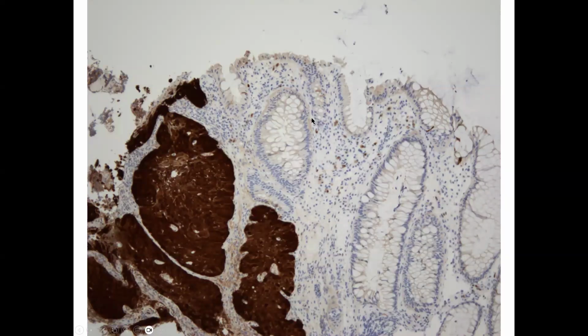One of the ways you can identify this with special stains is a stain for P16, which is a surrogate for HPV infection. Here there's very strong diffuse staining for P16, which supports that this is an HPV-driven dysplasia. There's also an alternative stain you can use: an in situ hybridization for high-risk HPV that we can use for these lesions.